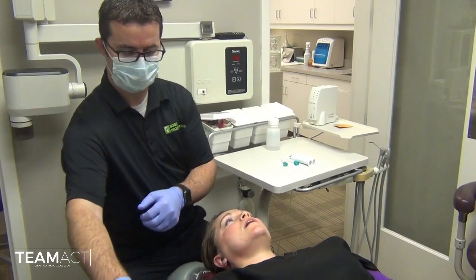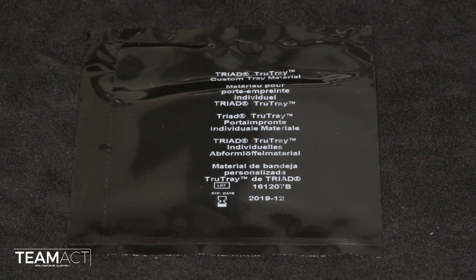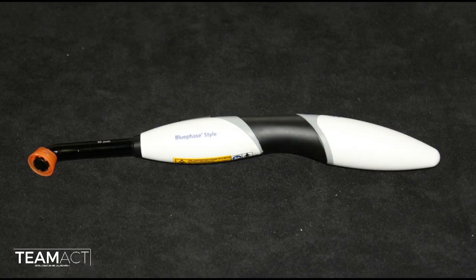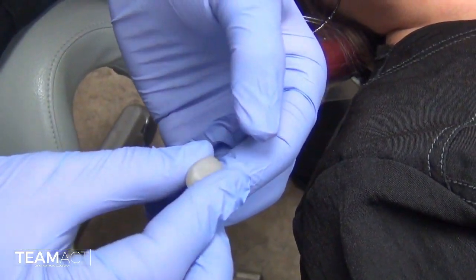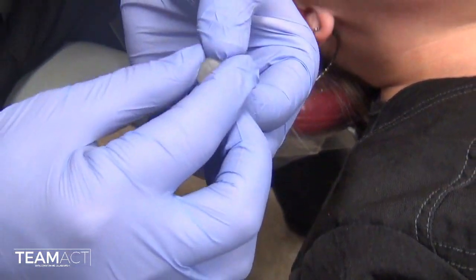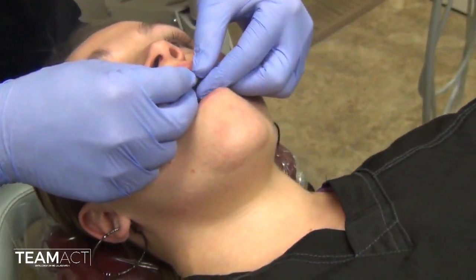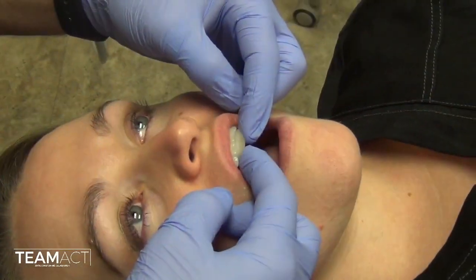We are confident with this case that we have found that position. I like to use a little piece of triad tray material to be able to manipulate and close her into that position. I make a little bead of triad and place that over her central incisors onto the lingual and lightly over the occlusal buccal surface.